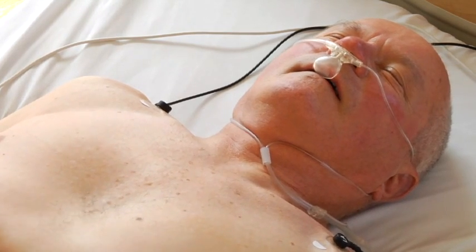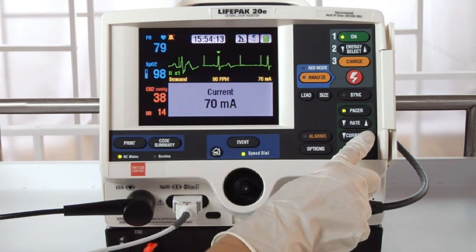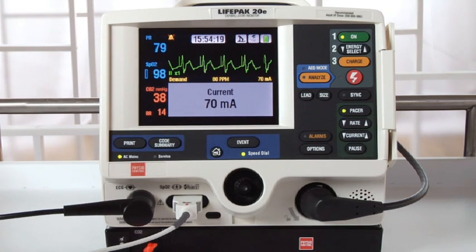You should notice the patient beginning to twitch. Increase the current until you see electrical capture. You'll have electrical capture when each pace marker is followed by a wide QRS and a T-wave, like this. Be aware that the average current needed for capture is between 50 and 100 milliamps.